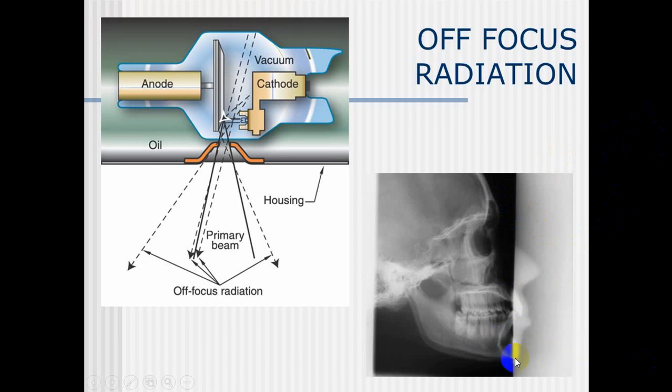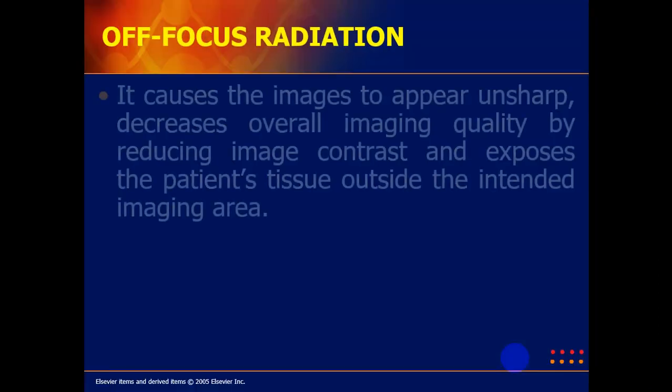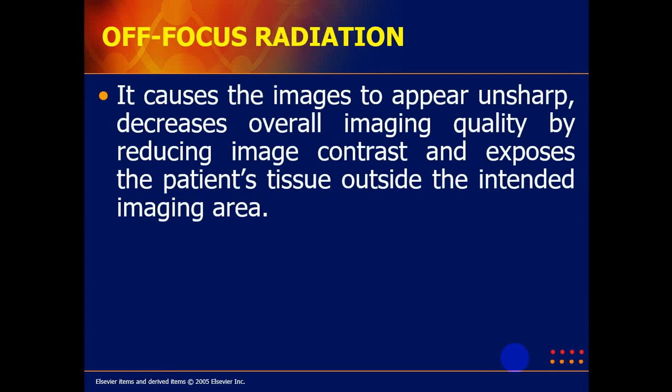It is not clear, no? It can cause an unsharp or low-resolution image. In off-focus radiation, images appear unsharp.